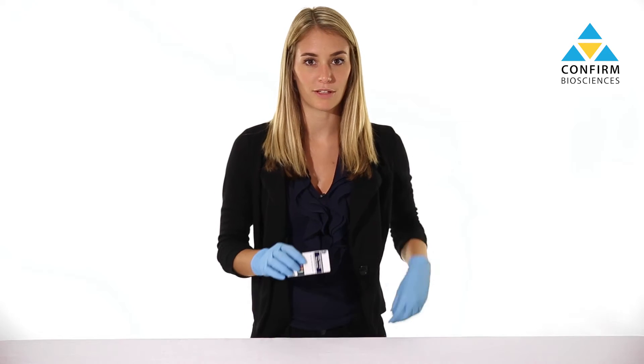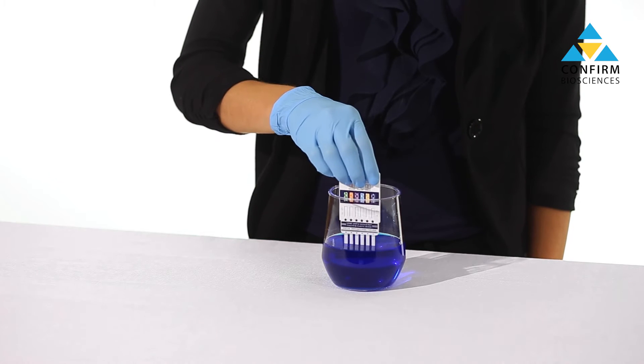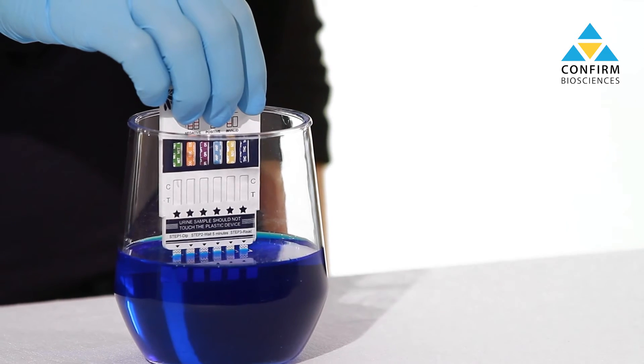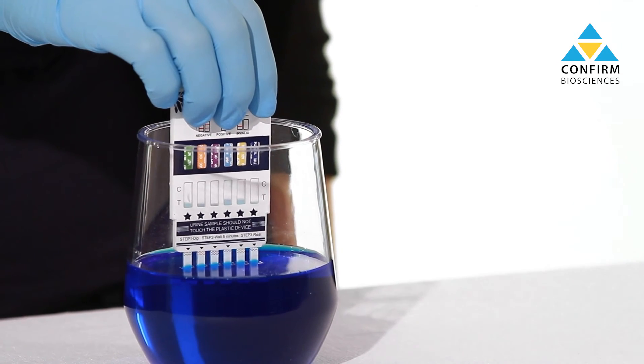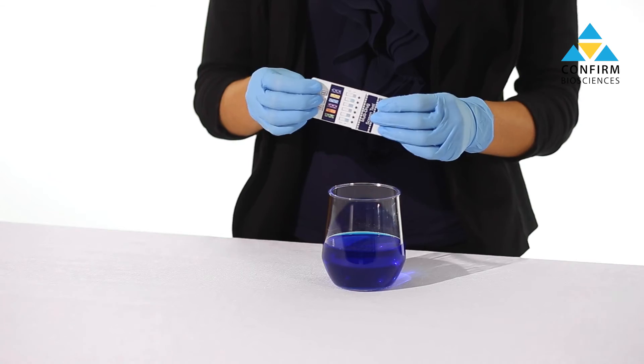After removing the device from the sealed pouch, pull off the cap to reveal the absorbent end. Immerse the card into a urine specimen for about 10 to 20 seconds. Make sure the urine level does not go above the max line printed on the device. Remove from the specimen, replace the cap, and lay the device flat on a clean surface.